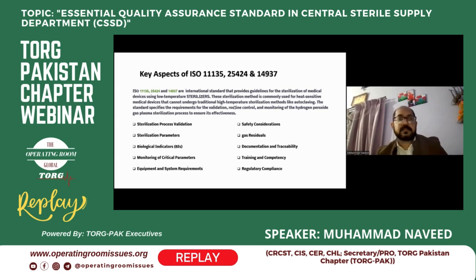The next one is key aspects of ISO 11135, 25424, and 14937. ISO 11135, 25424, and 14937 are international standards that provide guidelines for low temperature sterilizers. These are for devices that cannot bear high temperature. In most hospitals we use the plasma sterilizer with H2O2, ETO (ethylene oxide), and formaldehyde.